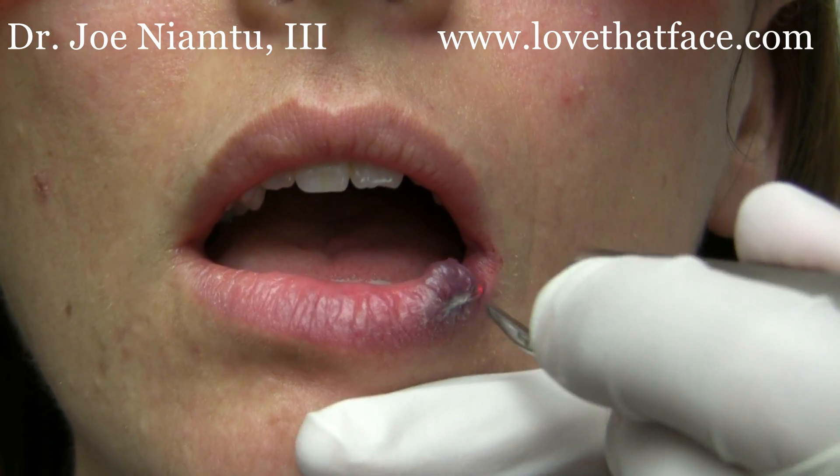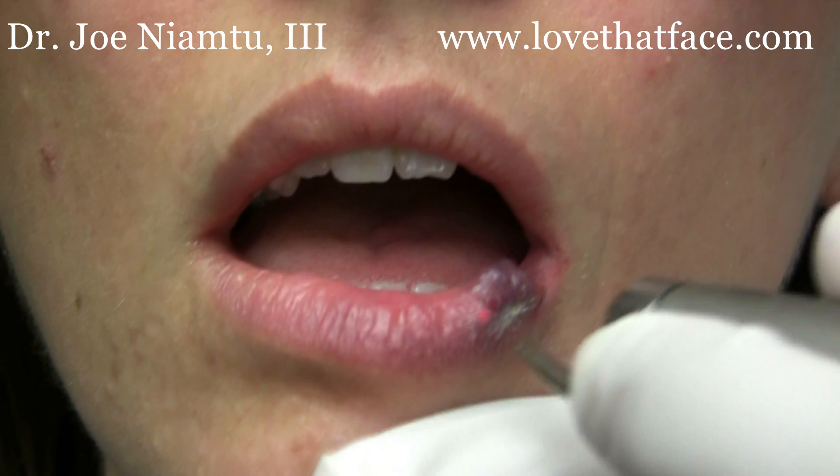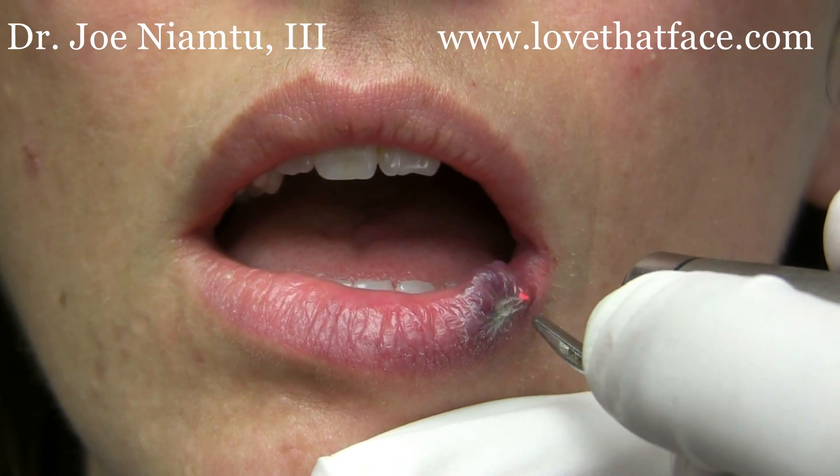And you can see how well it's responding, how well it is shrinking.